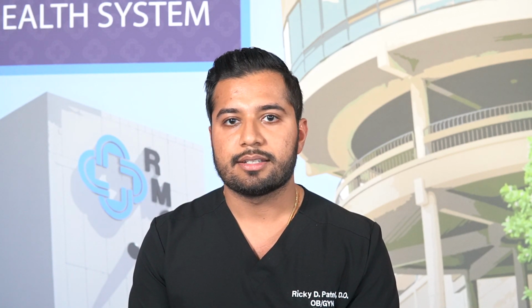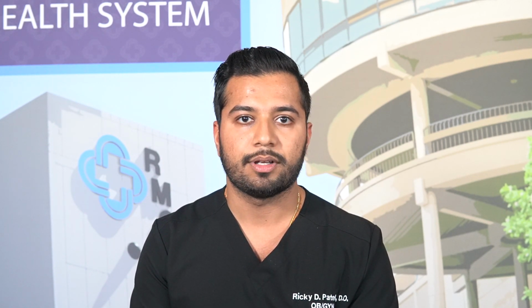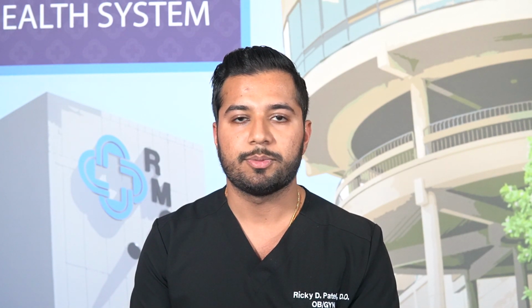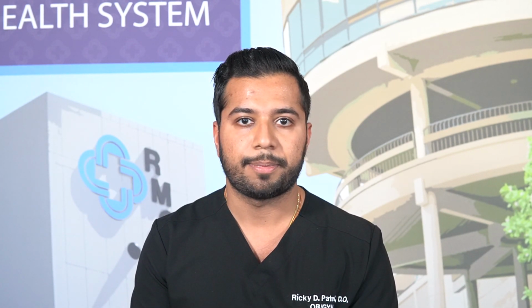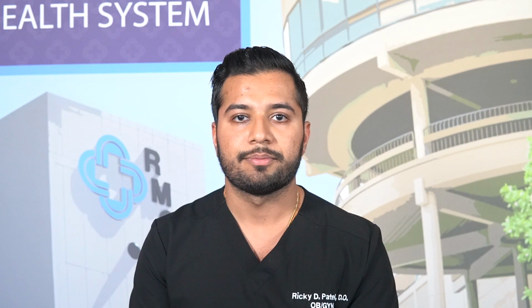For certain candidates, I'll do natural orifice surgery, which for us would be from the vaginal natural orifice. It's called V-NOTES surgery, so we can do tubals that are scarless, and hysterectomies, and adnexal surgery, which is also scarless, which is great.